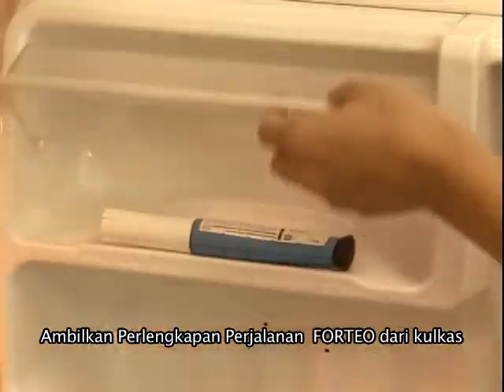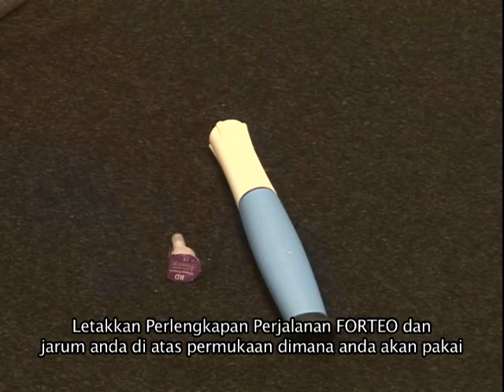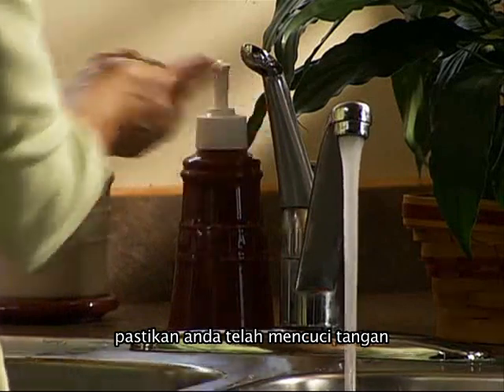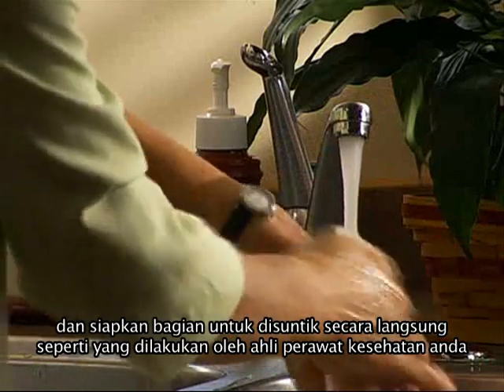Take the Forteo delivery device from the refrigerator. Put the Forteo delivery device and your needles on the surface you will be using. Before preparing the Forteo delivery device for use, be sure to wash your hands and prepare the injection site as directed by your healthcare professional.